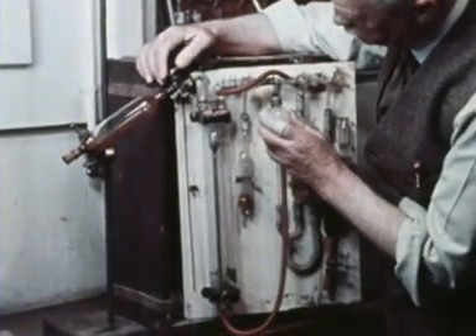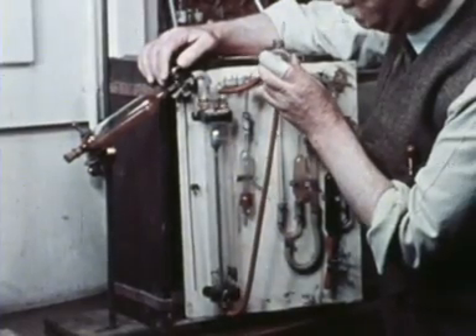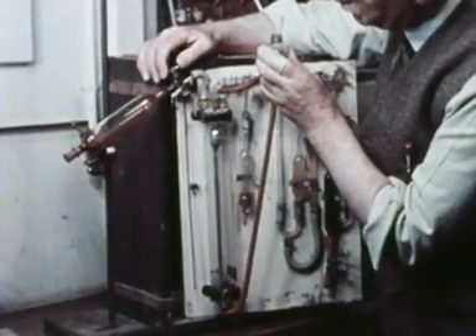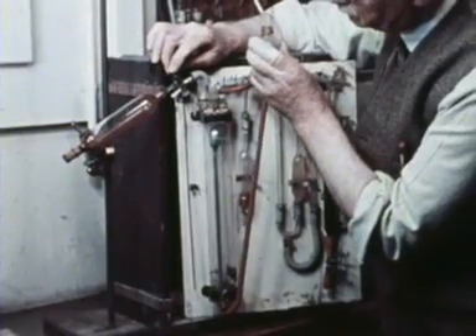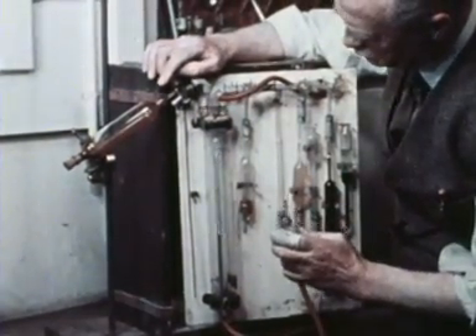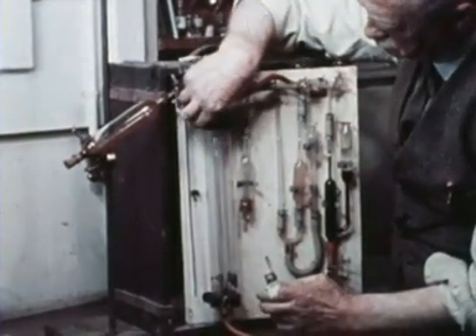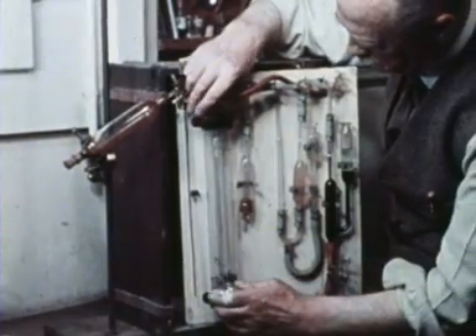He wants to plot this degree of saturation against the partial pressure of oxygen in the gas above, and a conventional Haldane gas analyzer forms part of his travelling apparatus. See how he has inverted his tonometer so as to draw off the gas phase instead of the liquid.